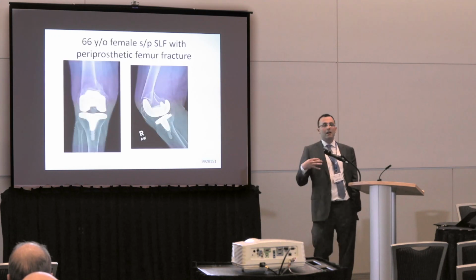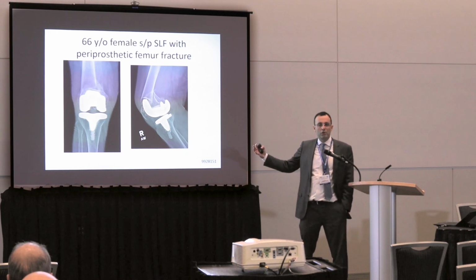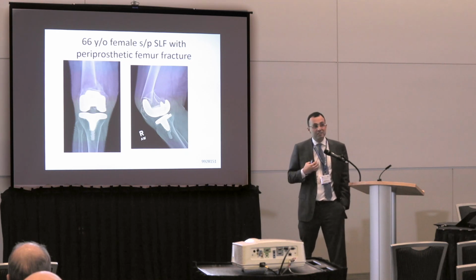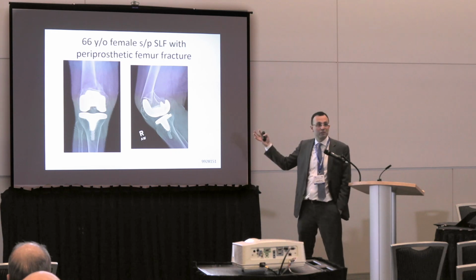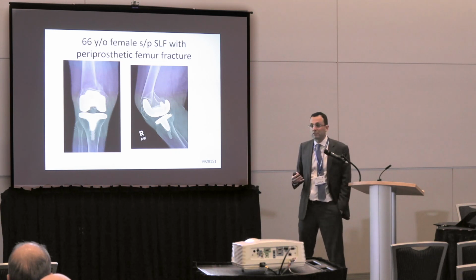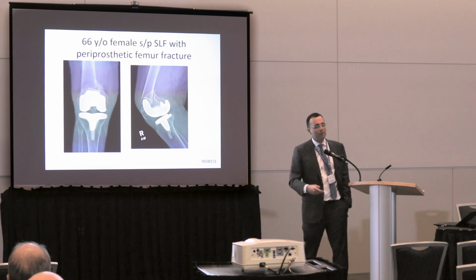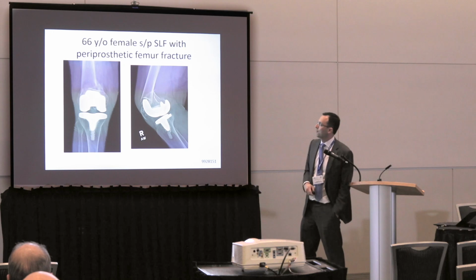So, as all of you know, not everyone is going to have all these 3A destroyed distal femurs. I think a majority of my cases, as you saw in my description of my cases, as well as what I'm going to show you, we have a lot of these older people with periprosthetic fractures. As we continue to move forward in time, we're going to see more and more periprosthetic fractures. I love this implant for that.